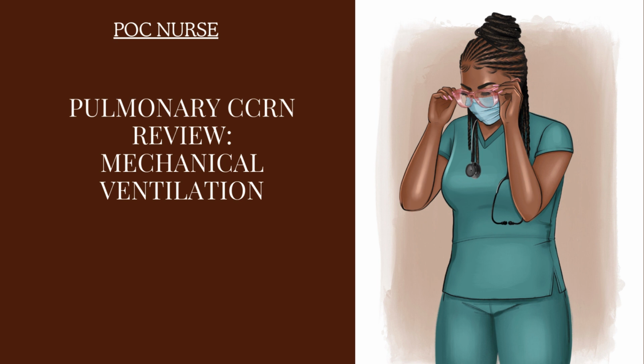It can be applied to patients through artificial airways, such as the patient that's intubated, a full face mask, such as the patient that's on the CPAP machine, nasal mask, think high flow, and nasal prongs as well, high flow. In this case, PEEP helps with oxygenation because we just talked about PEEP increasing the surface area of the alveoli that's available for gas exchange.